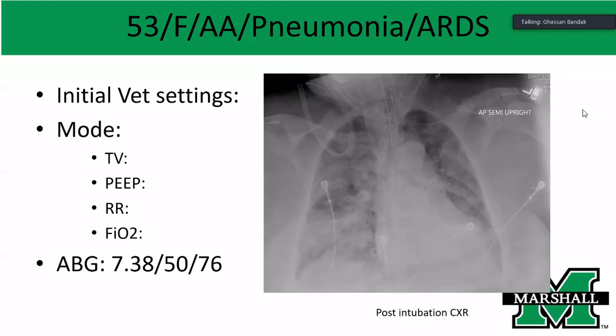So I just wanted to share this case with you guys. You're right. For obese patients, we may need higher PEEP, but why is that? It needs more pressure to open the alveoli because there's extra pressure, compression on the chest, so you need higher pressure from the inside. Okay, so that's why when I said a PEEP of 10 might not be appropriate. It may not be, but in this case, the patient is morbidly obese. I would go higher, right?